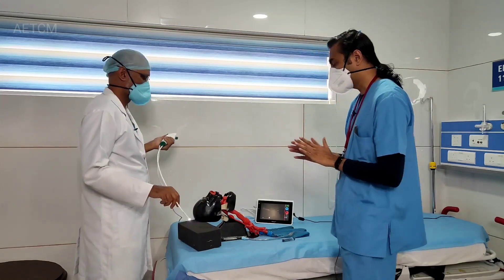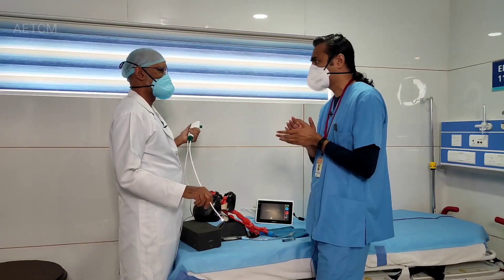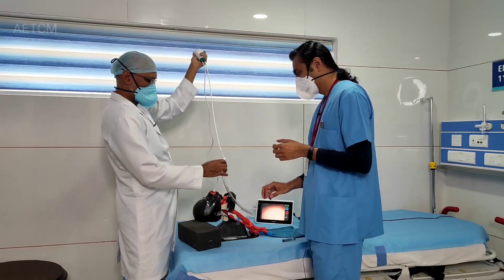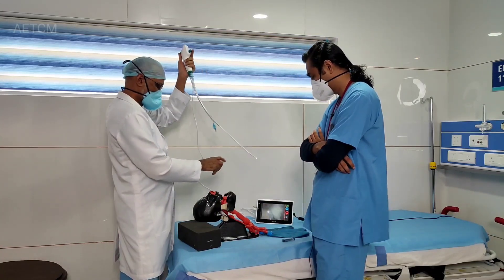Now we'll discuss one more scenario — we use this in the ICU to do a lavage. I'll intubate through the nose because it's much easier. I can see the cords, the glottis and everything. I've manipulated, I'm just about to enter — I've entered. I push it all the way down and the intubation has been done.